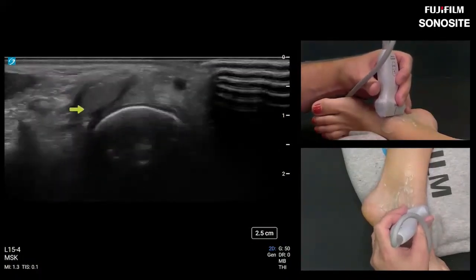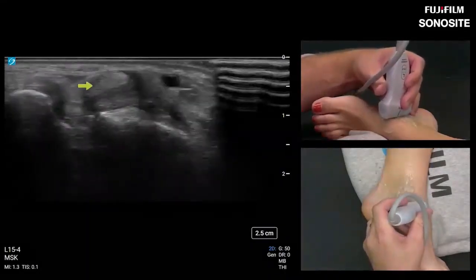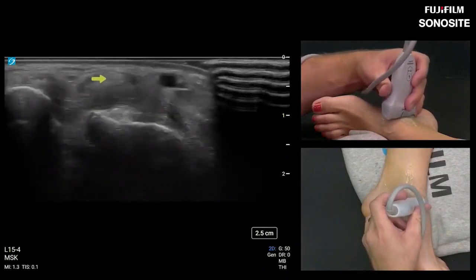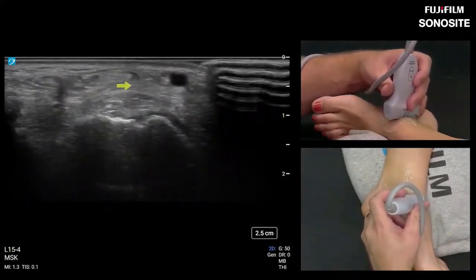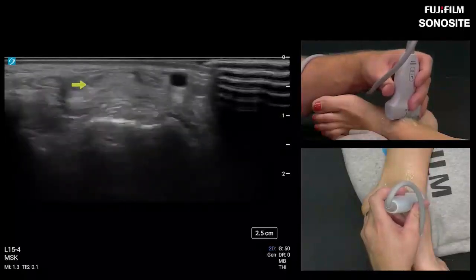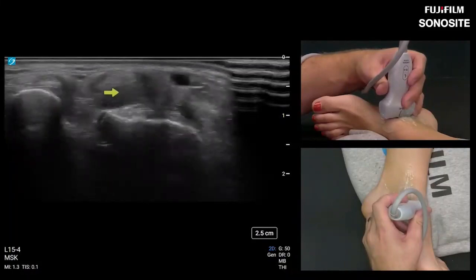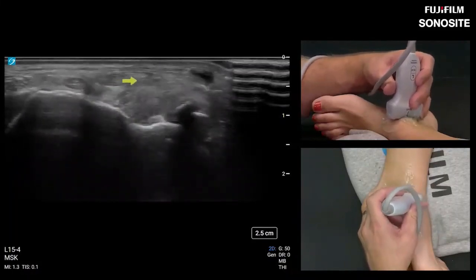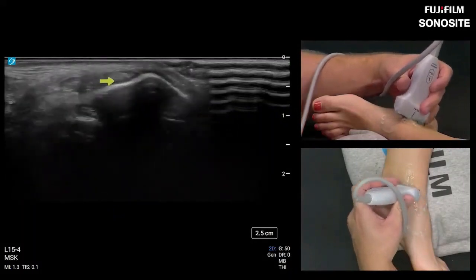So just to check our work there, we're just going to creep up towards the medial malleolus in little 1 centimeter increments. We're just going to walk back and forth, and we're going to watch this tendon as it ovals out, and it's resting on top of the ligament complex that we just scanned like a hammock. And we're just going to keep following it, keep following it. There we are, back at the medial malleolus.